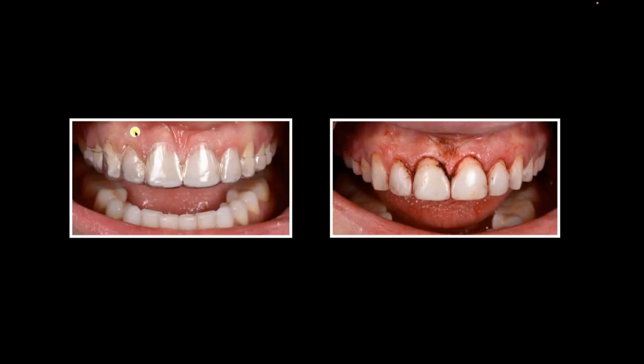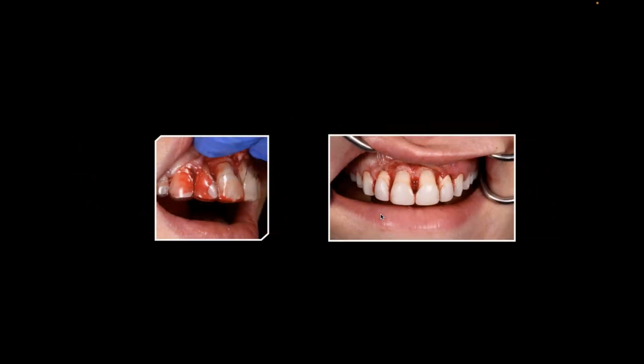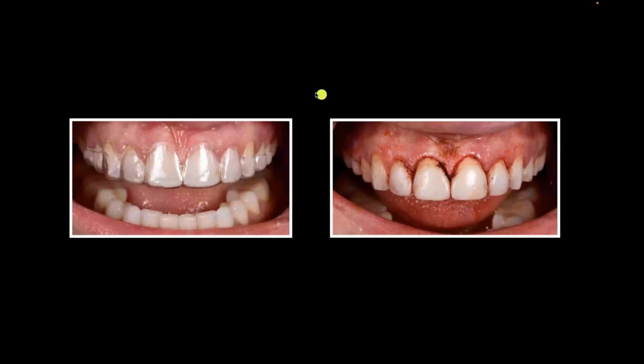So she'll electrosurge away the tissue, and then she'll either flap or chisel, depending on how many teeth she needs to do, to position that new gingival margin for us. In this case, she flapped, as you can see, and she'll develop the bone relationship to where we want that final pink marginal interface to be. I think most of us know that there's a 3 millimeter biological width that we want to stay working in. So once we've decided where the tissue will be, we want to make sure that our bone level is 3 millimeters away.